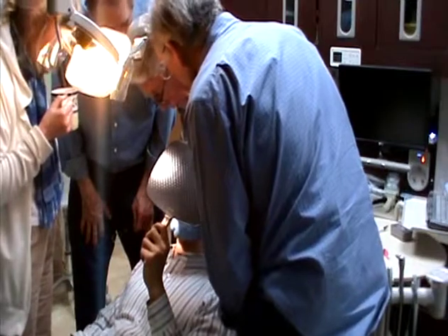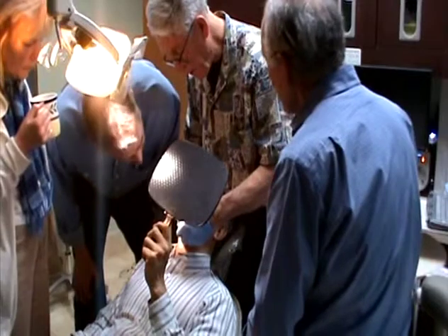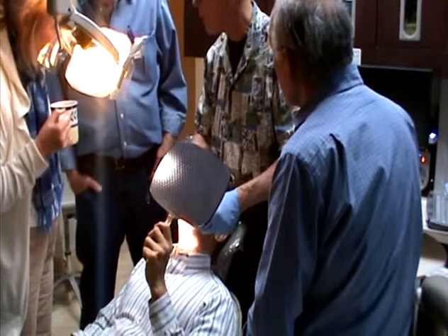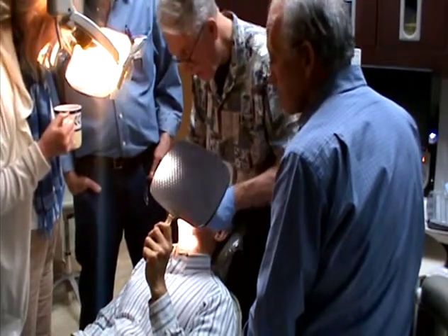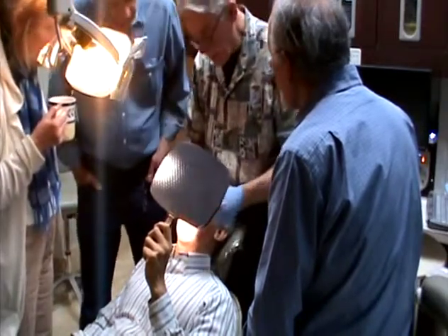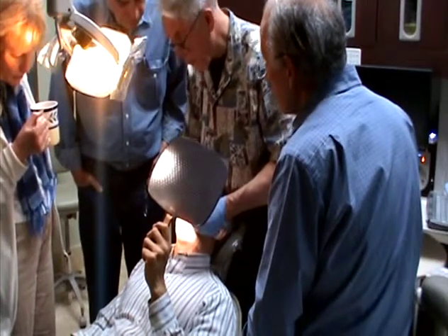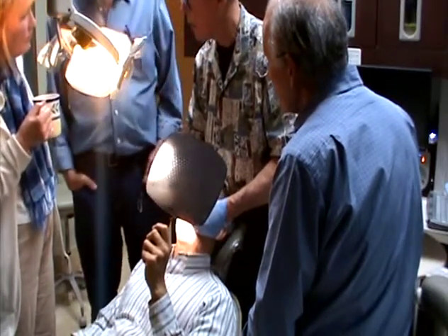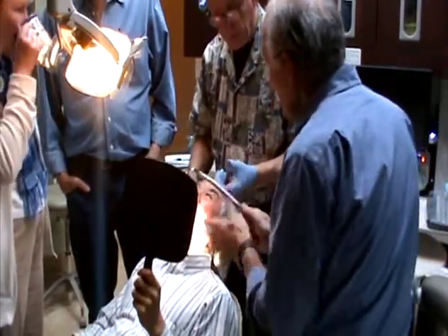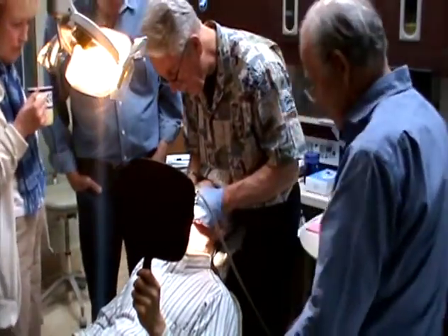And now slide down, slide this way. And when he slides that way, he's not supposed to be hitting on this right side when he slides to the left. Right. Okay, open. Well, see what happens, the stop is on a marginal ridge here, but when he goes to slide, he slides up the incline on the whole lingual cusp. That's a balancing interference. You can feel it? Those are the ones that get people's necks and stuff, usually on the second molar, but he doesn't have them.